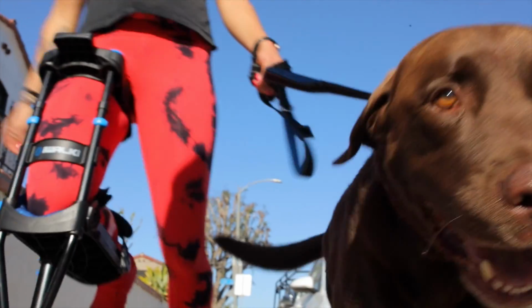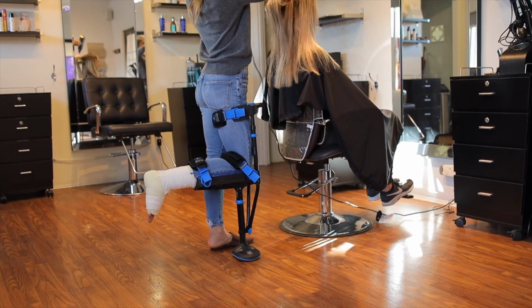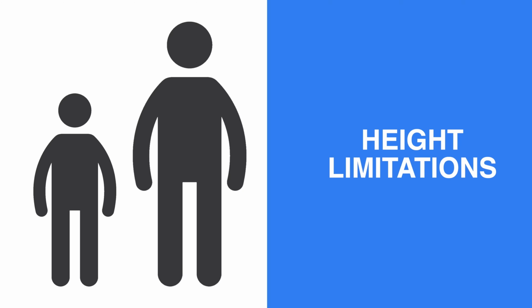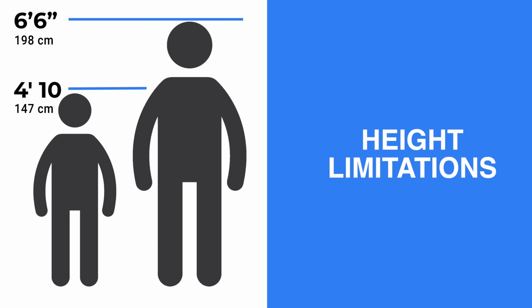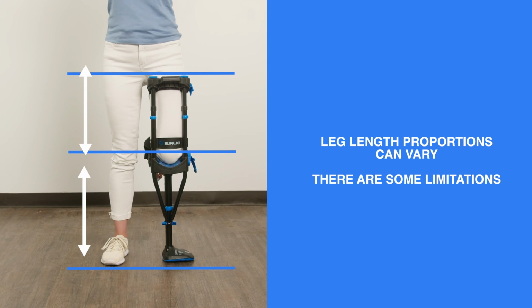Capacities and adjustment range. To ensure the success and safety of your patient, it's essential that you stay within the capacities and adjustment range of the iWALK crutch. Height. Most people know their height, so this is a good place to start. The iWALK works for most people between 4'10" and 6 feet 6 inches. But because leg length proportions can vary considerably, there are some limitations.